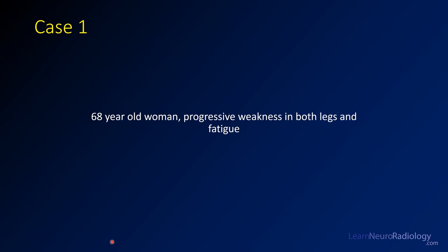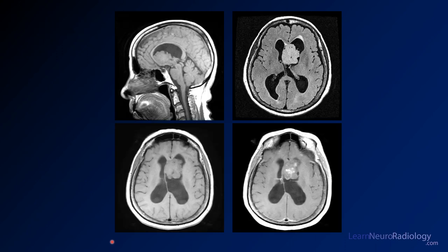For case one, this is a 68-year-old woman with increasing weakness in the legs and fatigue. Here are some images from an MRI of the brain. This is a sagittal T1 in the top left, FLAIR in the top right, and pre and post contrast at the bottom. You should try to get used to figuring out which ones you're looking at.